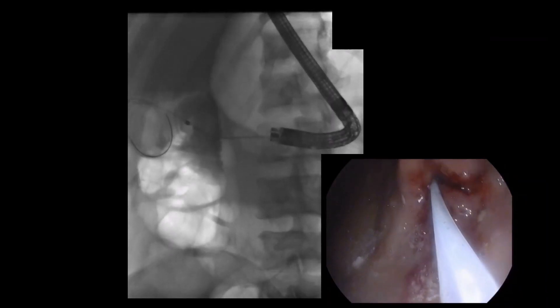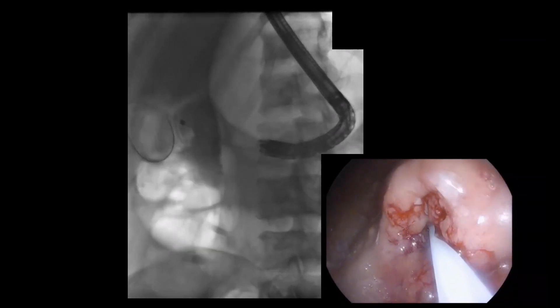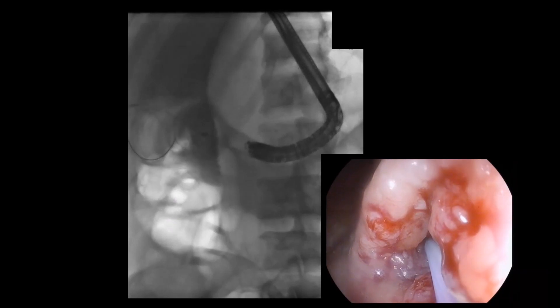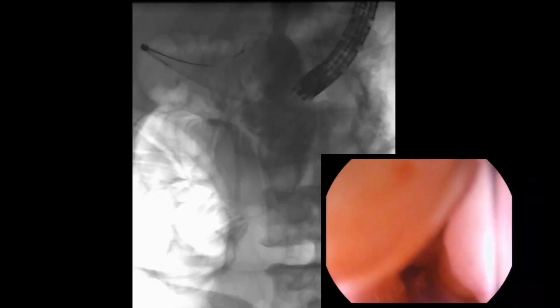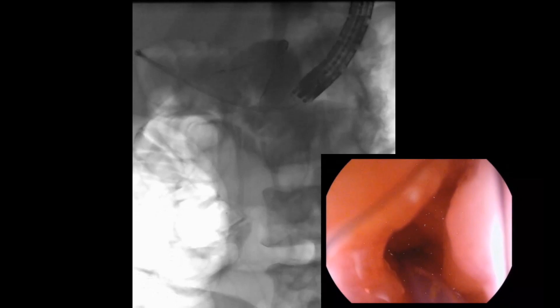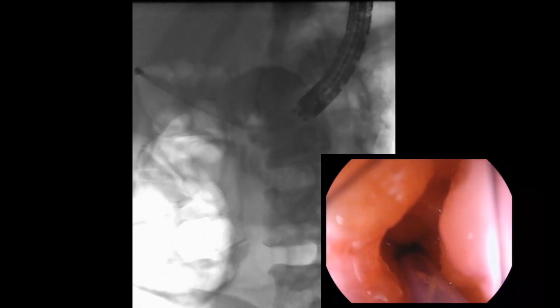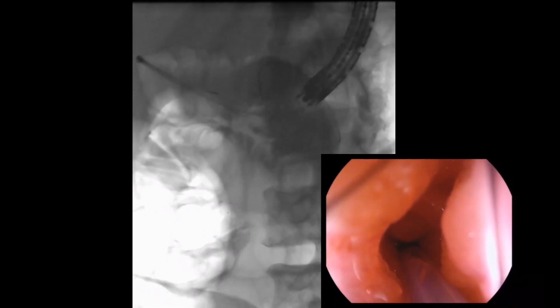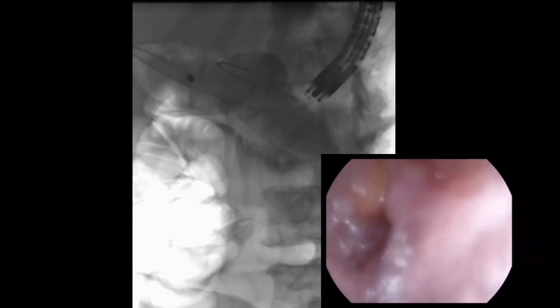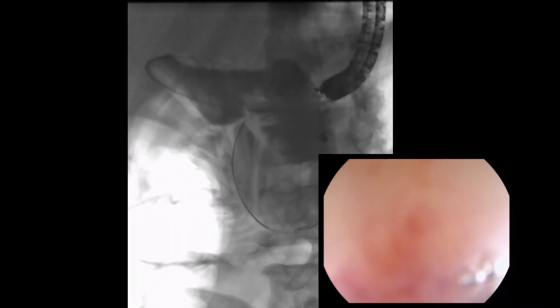Using a sphincterotome preloaded with a 0.025-inch diameter guidewire, the small bowel was selectively intubated. Contrast was injected to opacify the proximal jejunum. The sphincterotome was rotated to overcome the sharp angulation in the small bowel, thereby allowing advancement of the guidewire deep into the jejunum under fluoroscopic guidance.